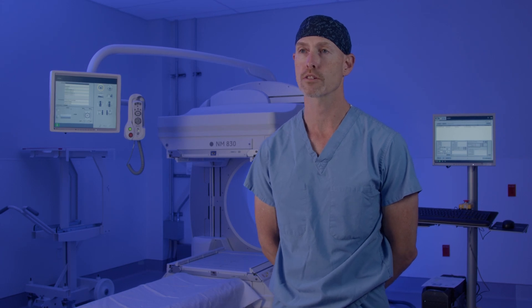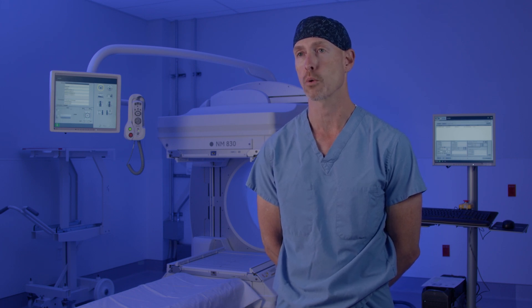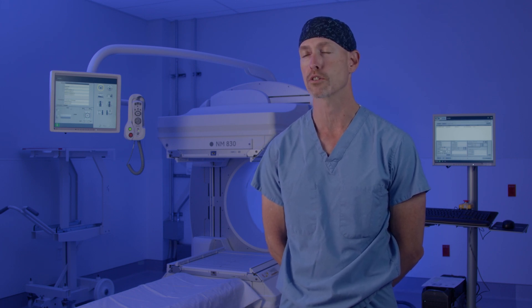Sestamibi scan is a nuclear medicine x-ray that takes about 25 minutes to perform. Lots of other places where the scan is done it can take several hours, but the way we do it here it's quite quick, so not a difficult scan to go through.